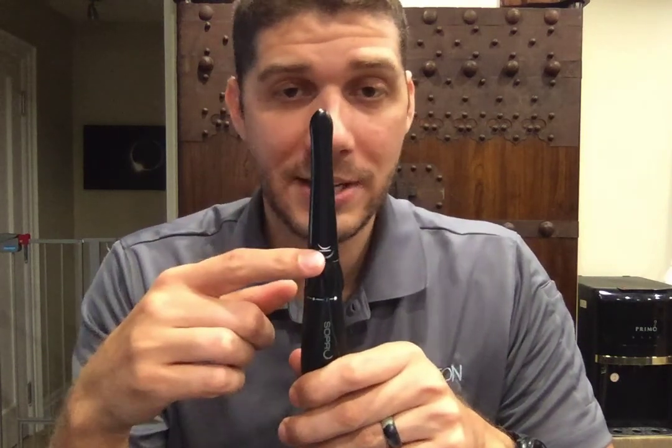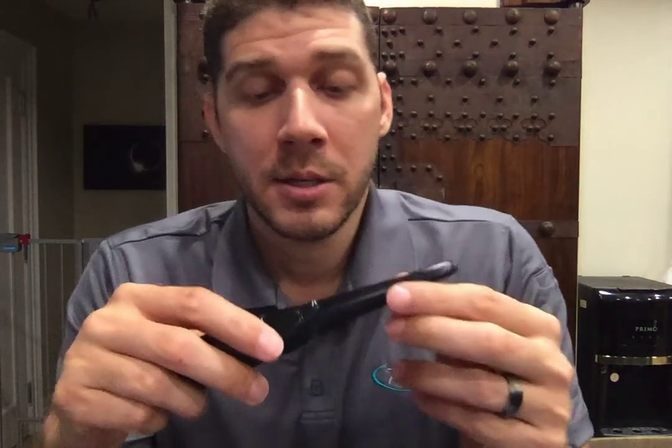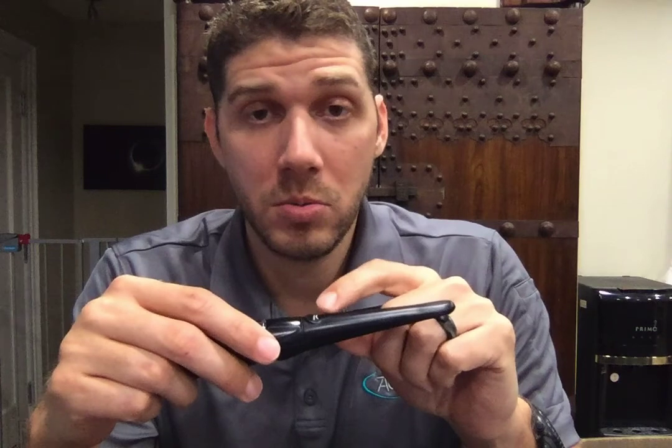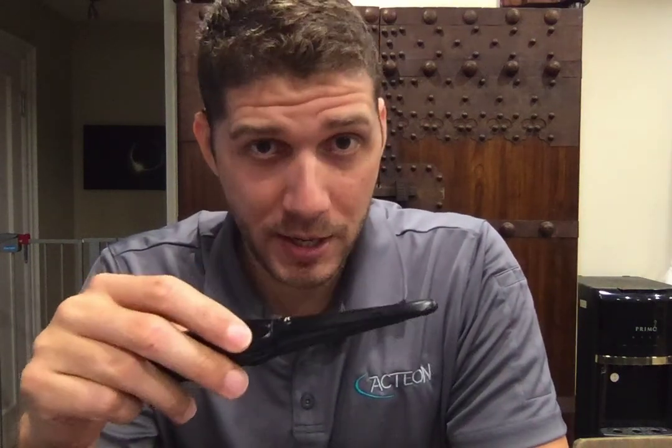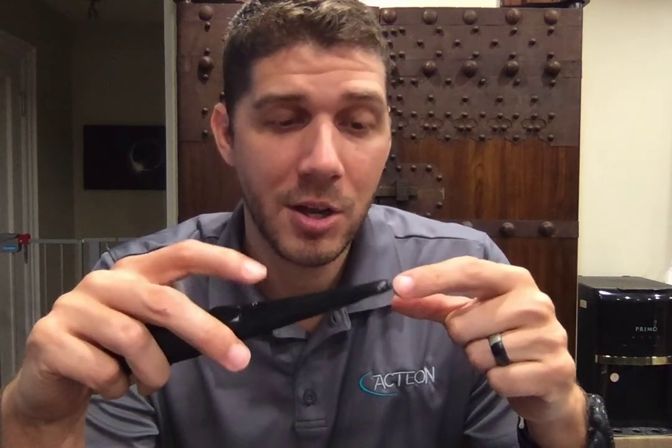Working our way down from the head, this is the SoPro touch feature. Some camera manufacturers put buttons to capture an image — we don't have a button. Instead, we have a touch feature. Buttons are great, people are used to pushing buttons, but look what happens when you push a button: the head's moving, and a blurry image is going to be generated. We don't want blurry images — we want nice, crisp, clear images. You're not going to get that with a button, but you will with our SoPro touch feature.